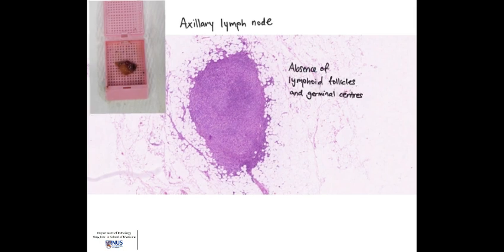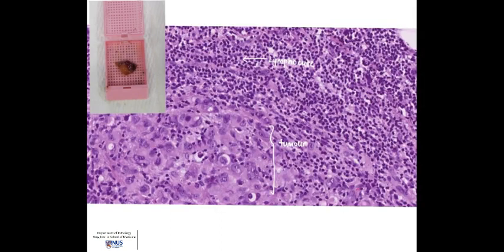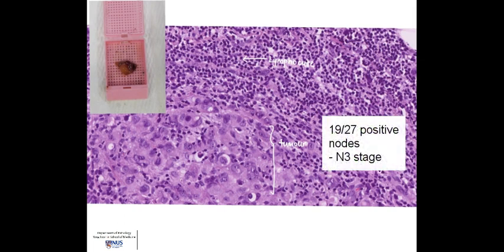At low power, there is an absence of lymphoid follicles and germinal centres. Zooming in, we see malignant cells with large nuclei surrounded by lymphocytes. After examining all 27 lymph nodes submitted for processing, 19 nodes were deemed involved by tumour. Thus, the nodal stage is N3.